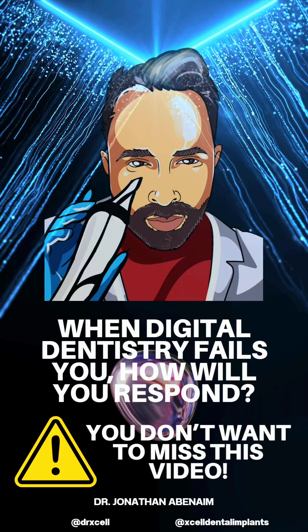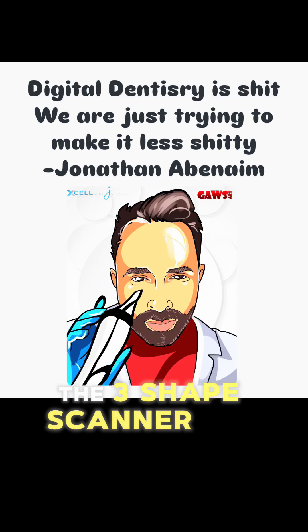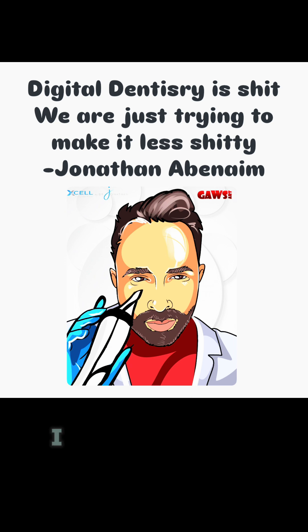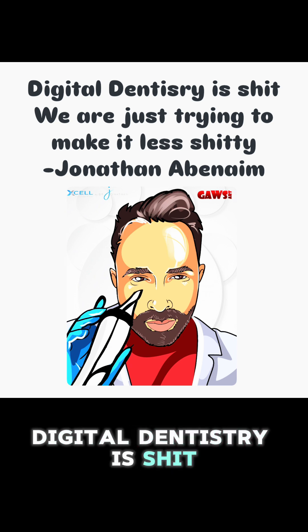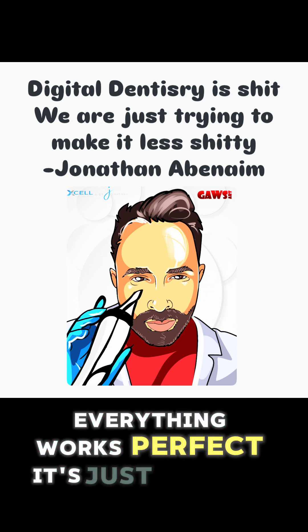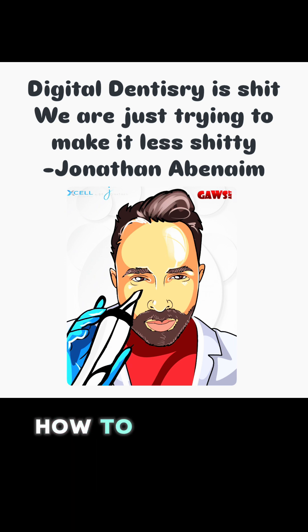Back for an edition of 'When Digital Dentistry Fails - How Will You Respond,' featuring the Shining scanner, the Three Shape scanner, and the IO Connect scan bodies. Keep in mind something very interesting: at the end of the day, digital dentistry is not perfect. Anybody who tells you everything works perfectly is wrong. You have to be ready when things go sideways - how to navigate and get through it.